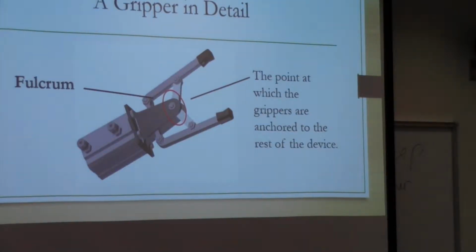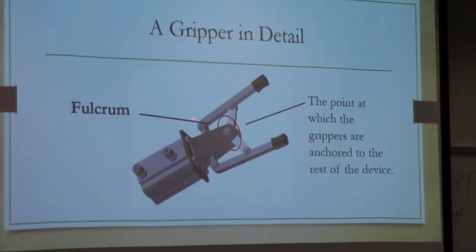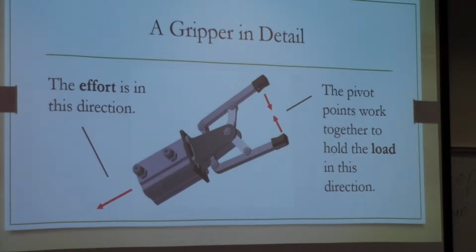So in this one, which is very similar to this one, the fulcrum is going to be where it's attached to the body. On this one right here, it's attached here. Every other point right here is free to move, at least in one direction. This is where it's attached to the rest of this. The effort is going to be in this direction. So on here, you can't see it very well, but to actually actuate it, there would be a string or something rigid that's going to pull this apart and actuate it.